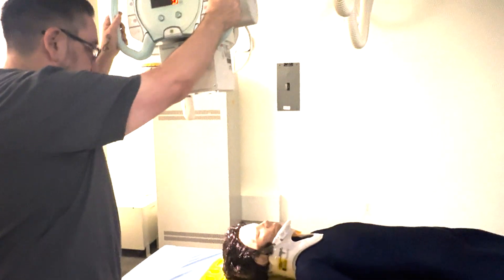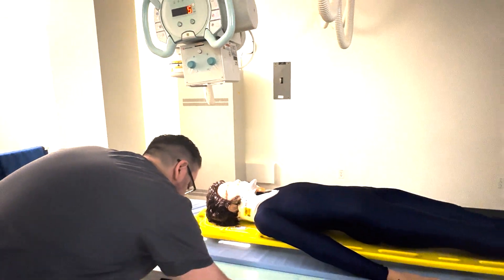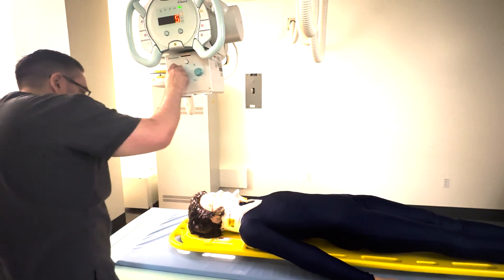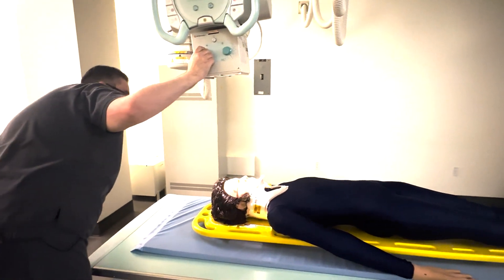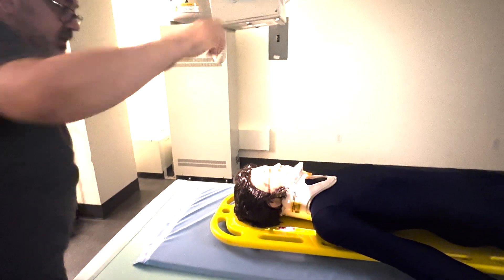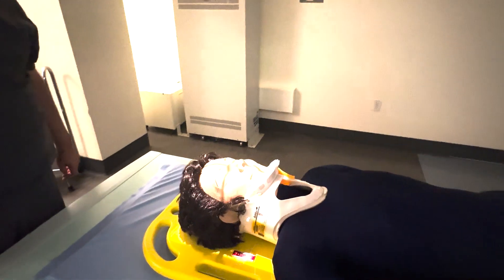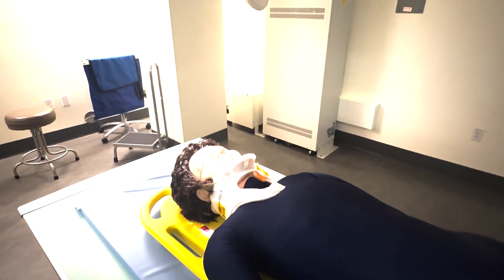I'm going to center this to my bucky, and then I can float the tube to ensure that I'm centered at the nasion. We have a little bit of rotation still on our mannequin here, but we're not going to worry about that. This is a trauma view — they could always come back later if they need a better view after the collar has been cleared. Shield and take on suspended respiration.